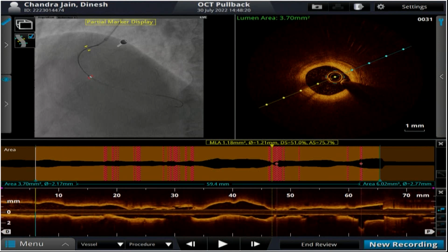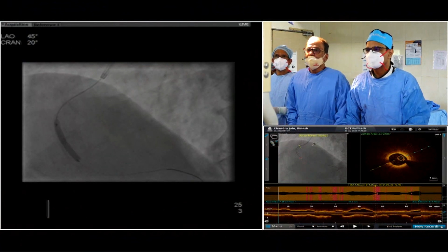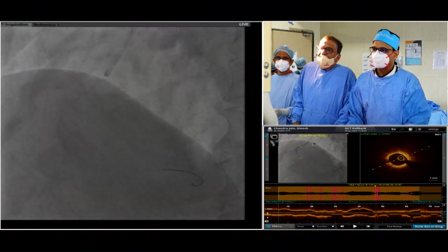Chinna, I want to see the previous stent inflation cine on the screen, on top, the landmark. Yeah. So what you use here is Stent Boost to have... Yes. We'll use Stent Boost. Yes, absolutely.